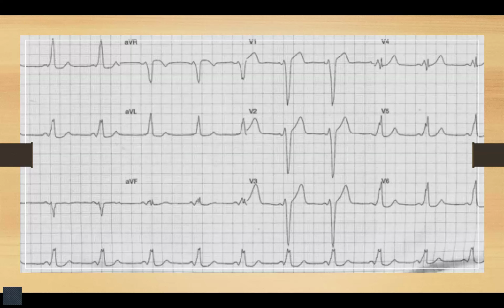Okay, they call this type B. You don't have to get too upset about type A or type B, but this is just another visual of getting you to look again at the EKG and think about this as a delta wave. If you now look for that, you can really see it in lead 1, but particularly you can really see it in 5 and 6, where there's that delta scooping as well. So that's another type of WPW. Really, you're seeing it in these lateral precordial leads.